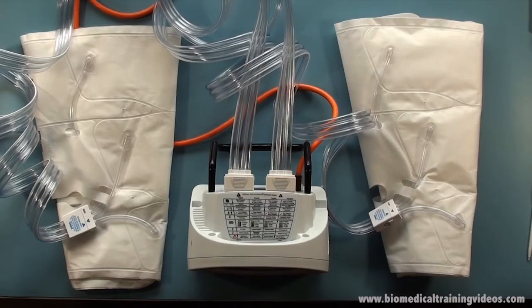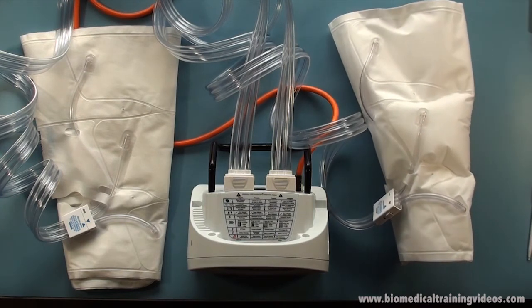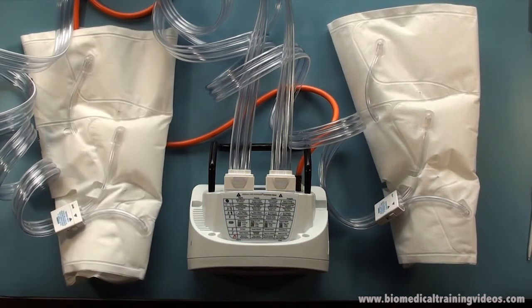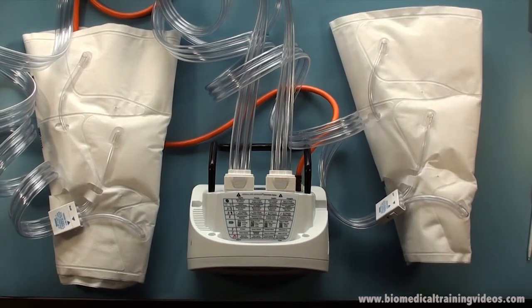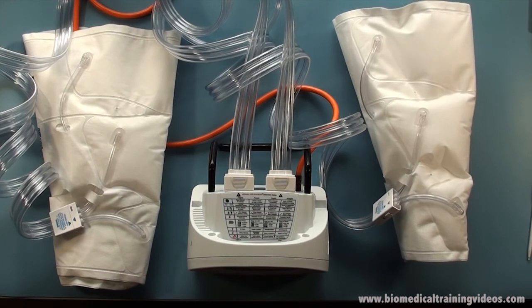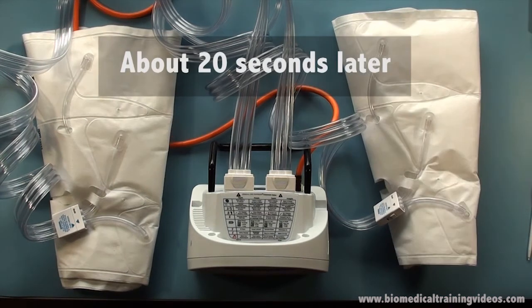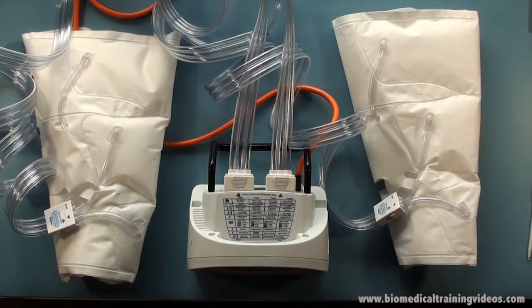Now I have got sleeves connected to both ports A and B, just to try and illustrate the cycling of the two cuffs. As you can see the right hand cuff is inflating, now the left hand cuff, now back to the right hand cuff again, and this cycle repeats. So it's fairly straightforward to test the unit and to make sure it's working properly.